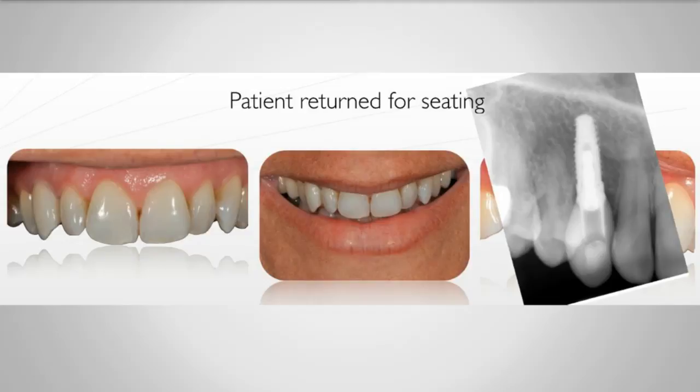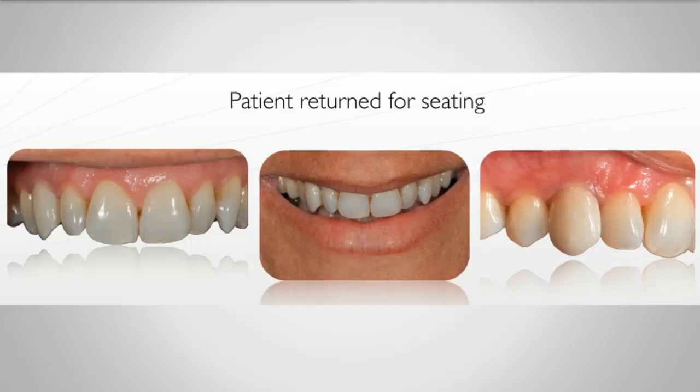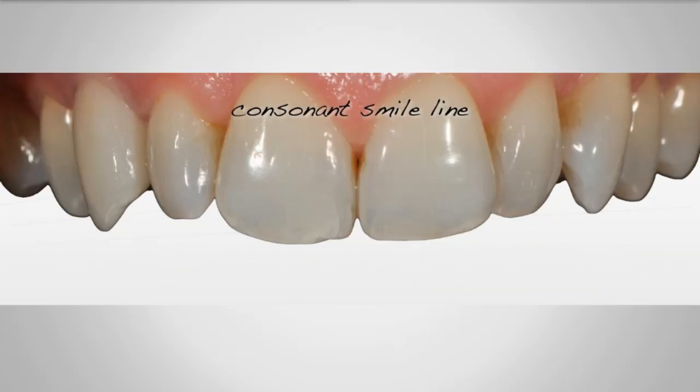Radiograph. Again, you can see this is a titanium base with a little bit of sliver up here, and then the porcelain is baked to that. I've not had one of these fracture or dislodge yet. All right, if you look at this close-up, you can see we have good healthy tissue, a pretty good shade and contour match with the contralateral tooth.